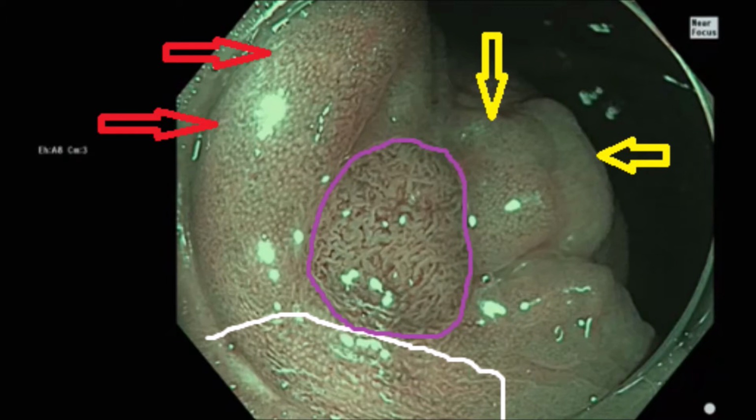And the other thing that is important, I think, is not so much just recognition of the adenoma recurrence, but recognition of what is not recurrence, recognition that there's clip artifact there that doesn't need to be removed. The target for our treatment is that area within that purple circle.